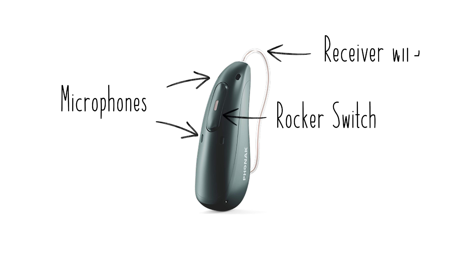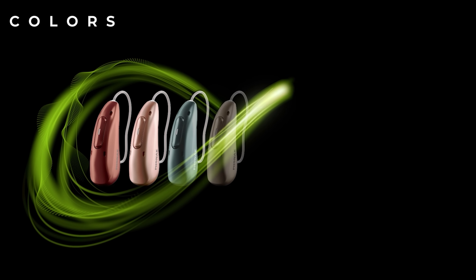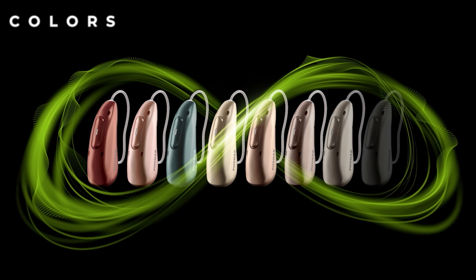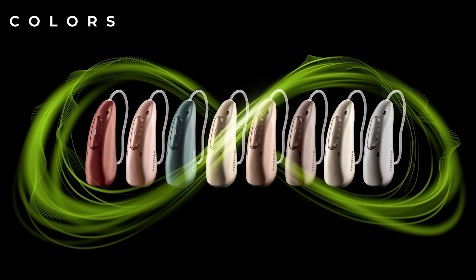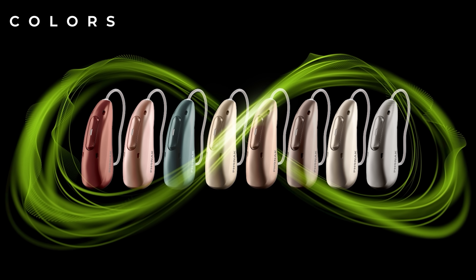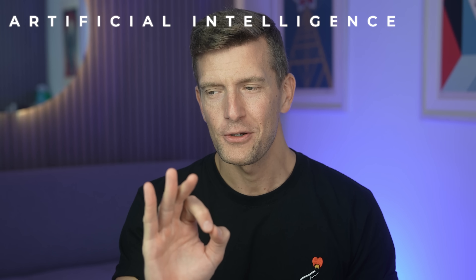Finally, you'll see the receiver wire which feeds energy and information to the speaker which sits inside your ear. As far as colors go, there is a wide selection available, including this sage green color which I really like. They're all matte nowadays, so they don't tend to catch the light, and most of my patients go for a color that matches their hair, with the most popular color being champagne.